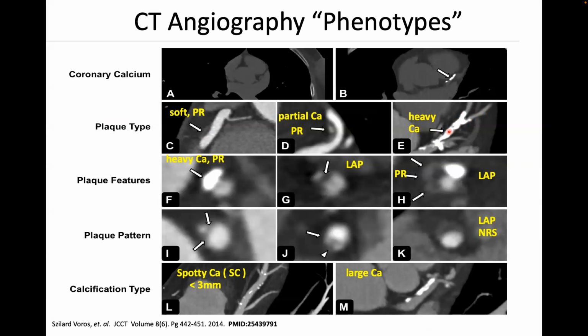So I would say one of the unsolved problems in coronary CTA is, how do you create a CTA image that is only representing the contrast filled blood and the calcium gets deleted, right?